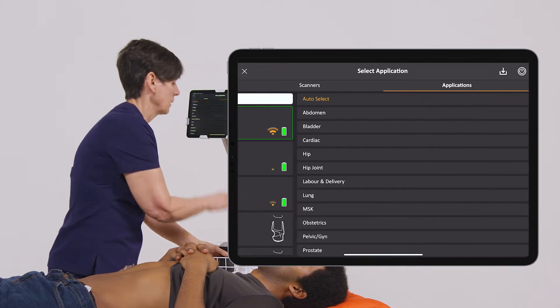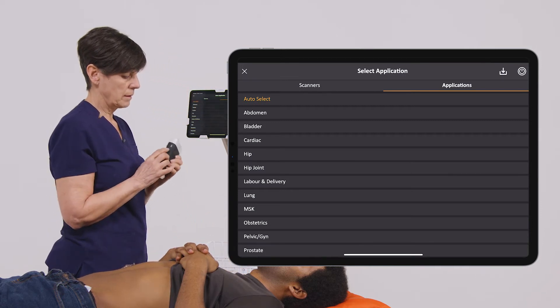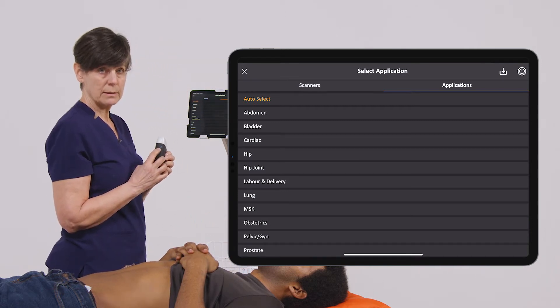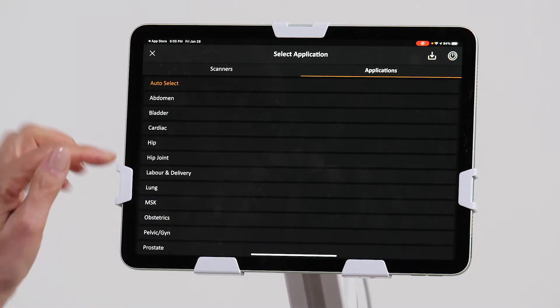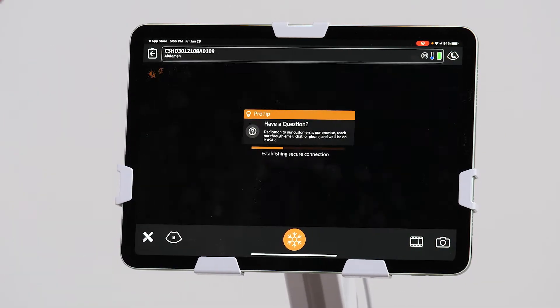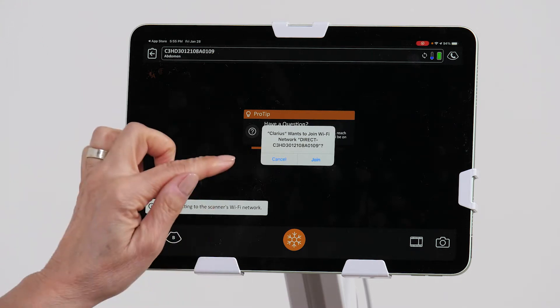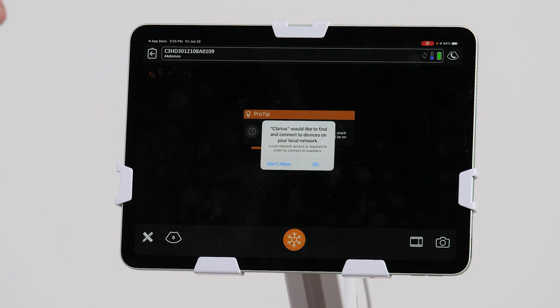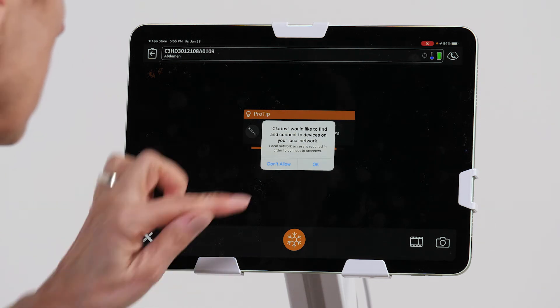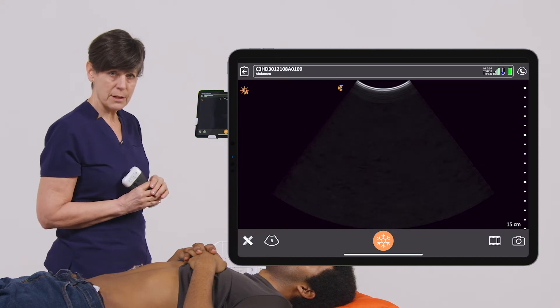I'm going to connect my scanner, and if the blue light is flashing, that means that the device is pairing with my scanner. I'm going to select the abdomen preset, and we're just going to wait a few seconds until we can start scanning. We can join the network, and now we're ready to start scanning.